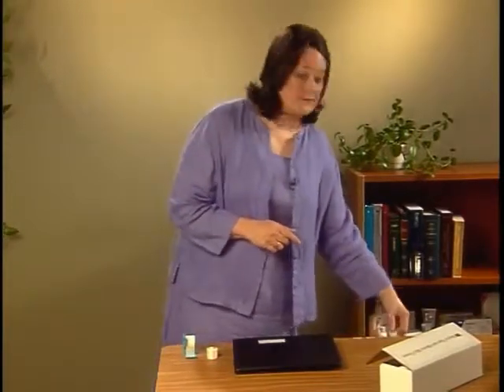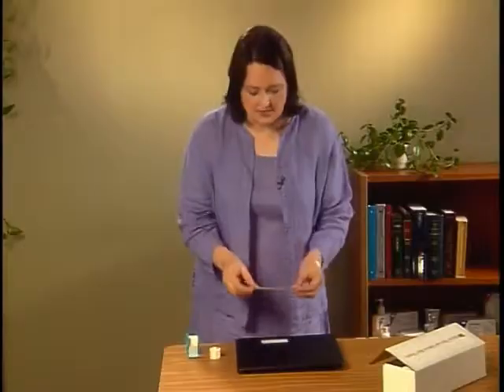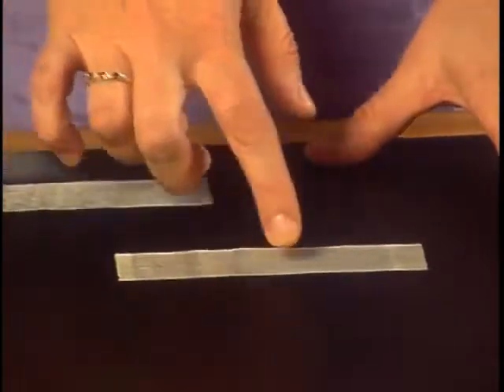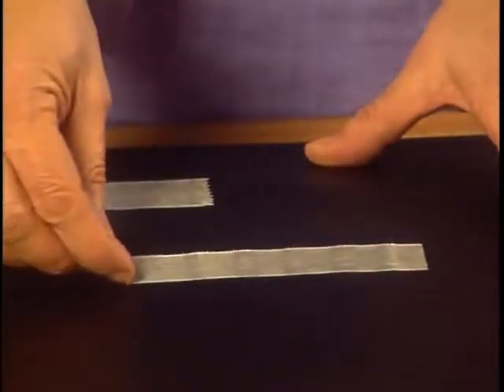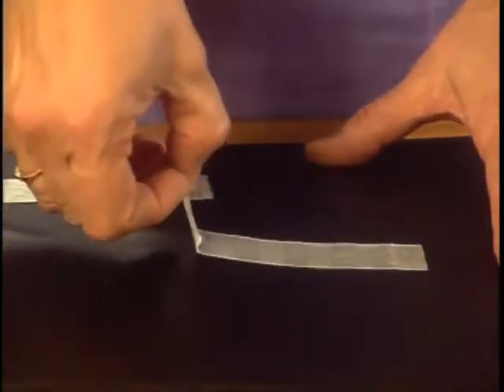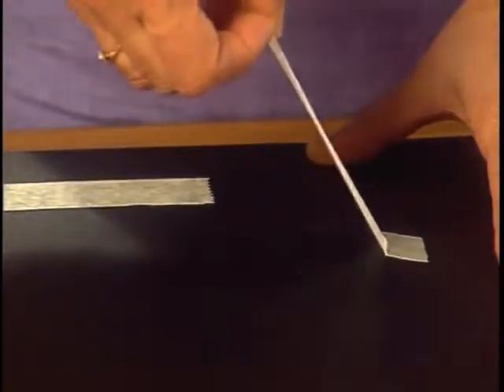To see what a difference stroking can make in adhesion, try this. Tear off about six inches of tape and place it on a hard surface and very lightly smooth it down. Every inch or so, press down or stroke the full width of the tape. Now pull the tape off. You can feel how the areas of tape that had pressure applied adhere more tightly than the areas that did not.